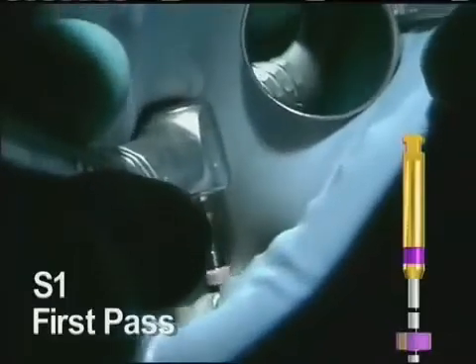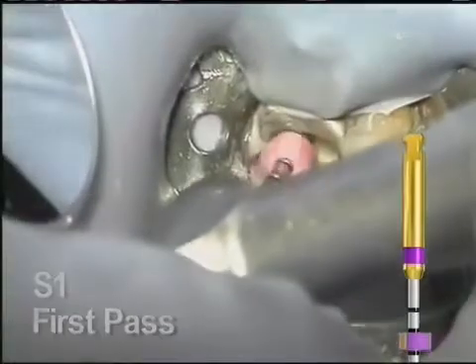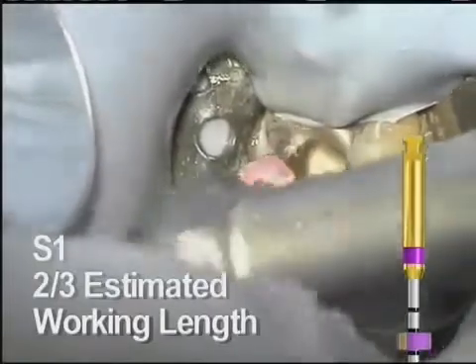Coronal shaping begins with the S1. This is used at 300 RPM and can be worked in a brushing manner to move the access away from the furcation. The S1 is taken no further than the depth of the 10 and 15 hand files worked with earlier. It may take more than one pass to get to that depth.